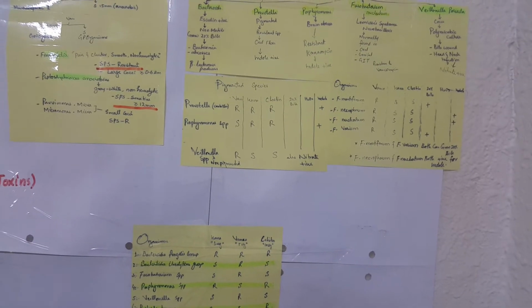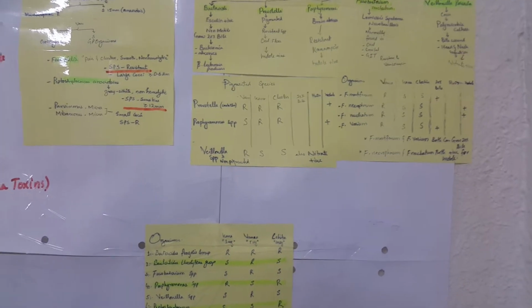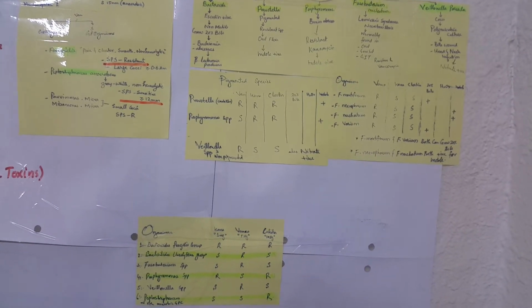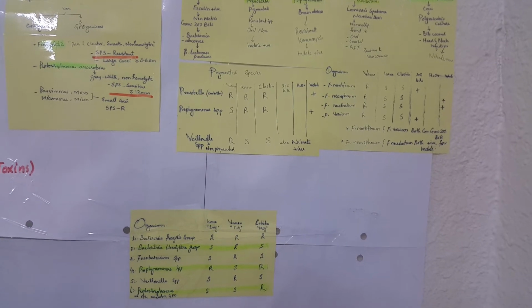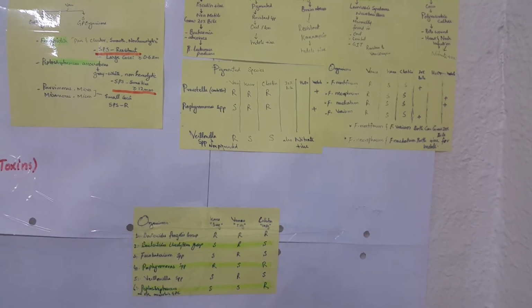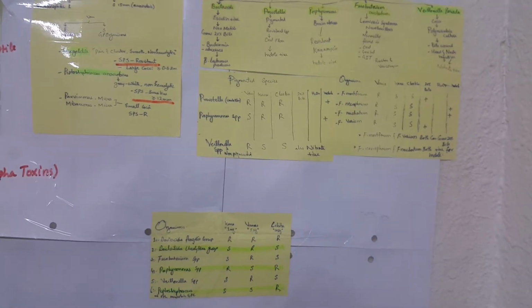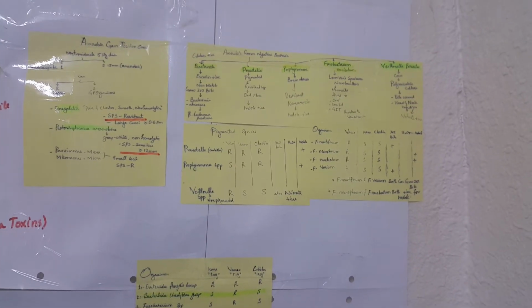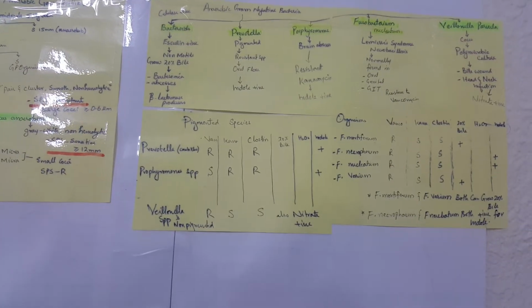Resistant to vancomycin. Veillonella, as we explained, is a gram-negative cocci. Veillonella parvula is found in polymicrobial cultures, like bite wounds and head and neck infections. It is the only organism in the anaerobic group that is a cocci and positive for nitrate. Fusobacterium is further explained in detail.